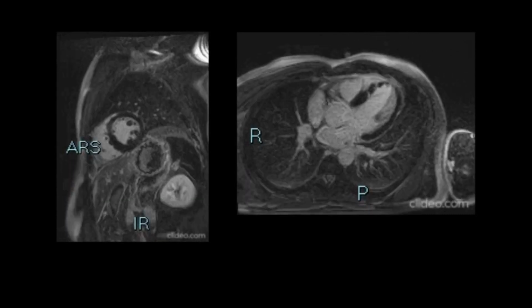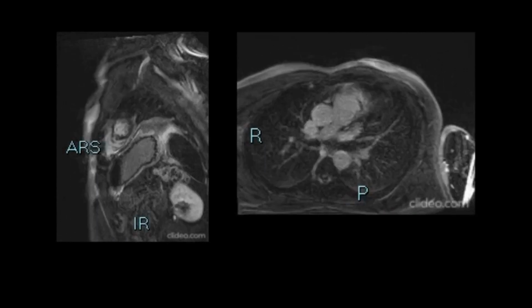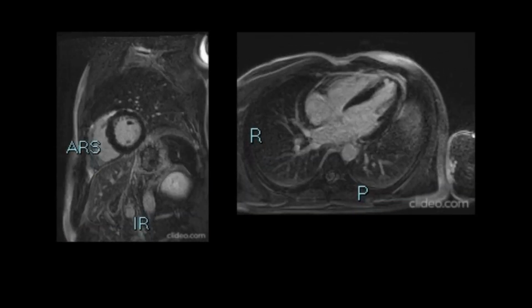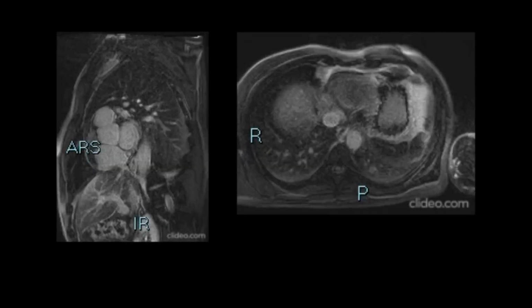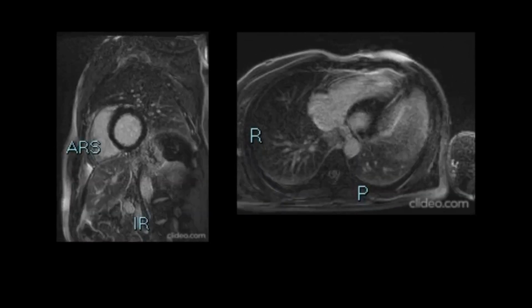For all these reasons, we concluded that the patient has multiple interventricular septal defects, spontaneously closed. This diagnosis will require close follow-up and subsequent cardiological checks.